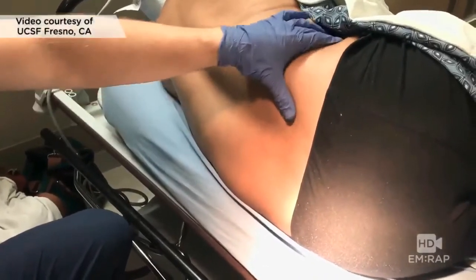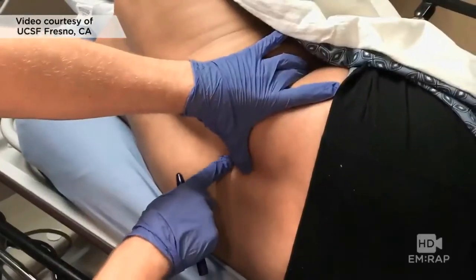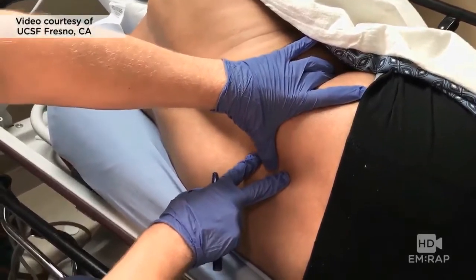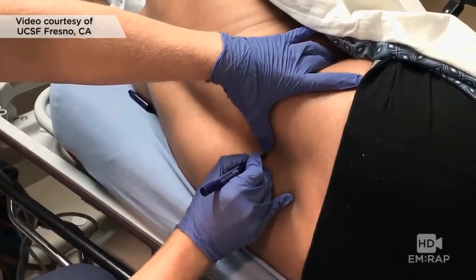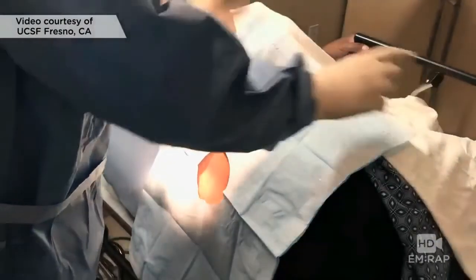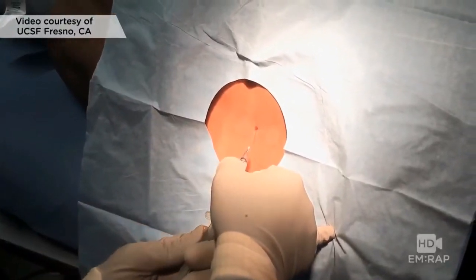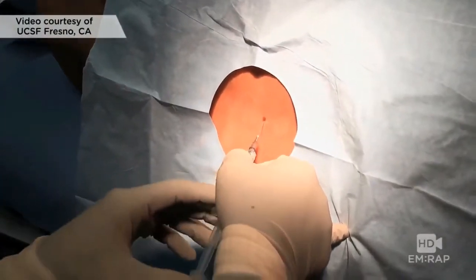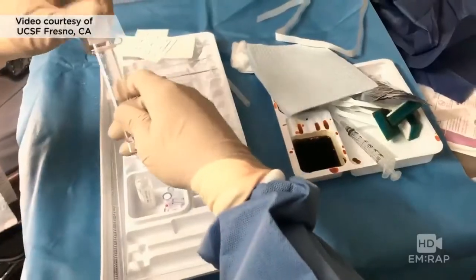Whether the patient is upright or lateral recumbent like this patient, identify the landmarks by palpating the posterior superior iliac crests — where they meet in the midline should be L4, which is below the termination of the spinal cord, and we don't want to poke the spinal cord. Place a mark at this level. Clean the skin with antiseptic solution and drape the patient to give yourself a sterile field. Anesthetize the skin with a wheal and then the subcutaneous tissue in the track that you're planning to pass the needle. While that anesthetic is taking effect, you can get ready.